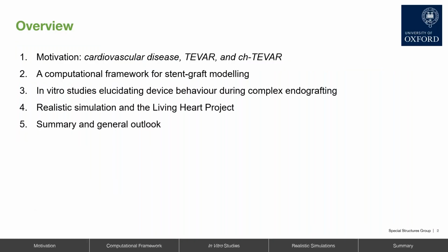Okay, so a bit of an overview. I'm going to motivate what we're talking about today and frame it within cardiovascular disease, and I'm going to focus in particularly on the treatment of aortic aneurysms, and that is thoracic endovascular aortic repair, or TEVAR, and a subset of TEVAR known as chimney TEVAR. I'll then outline, like I said, the computational framework we've developed, as well as some in vitro and benchtop studies. And I'll then finish things off with a general summary and an outlook.